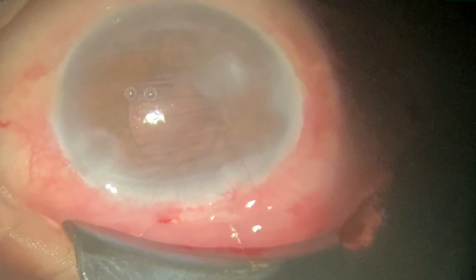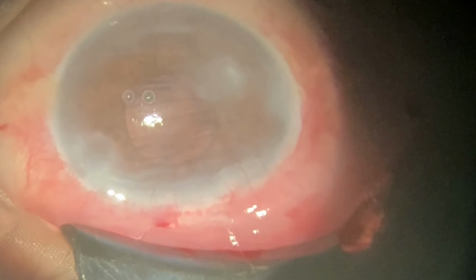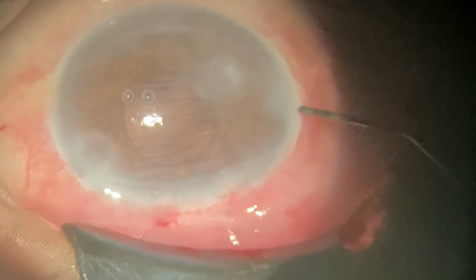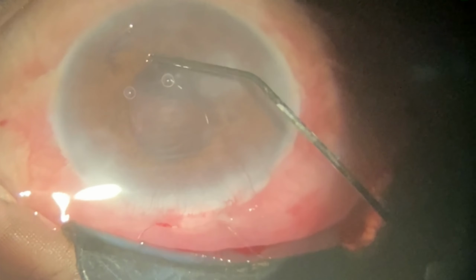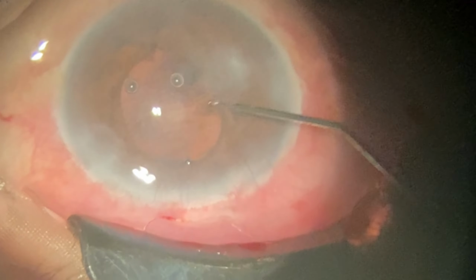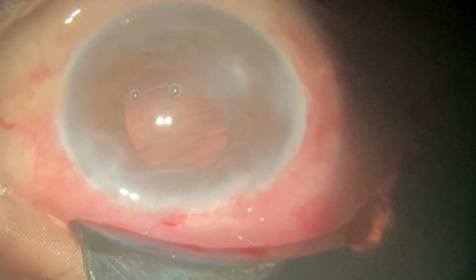And now using some adrenaline intracamerally to dilate the pupil so that I can check the presence of the sulcus in this case.